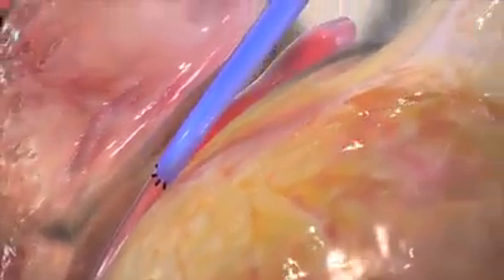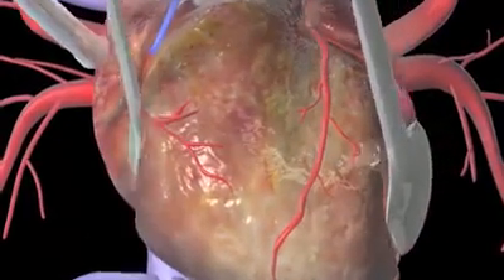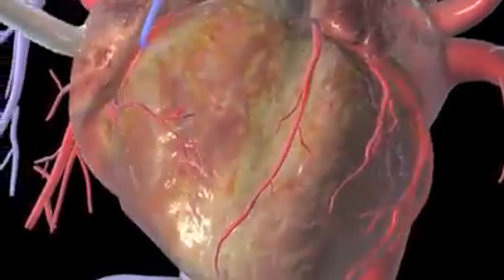your surgeon will use electricity to get your heart beating again and attach a temporary pacemaker to the heart. Once your heart is beating normally, she'll disconnect the heart-lung machine.